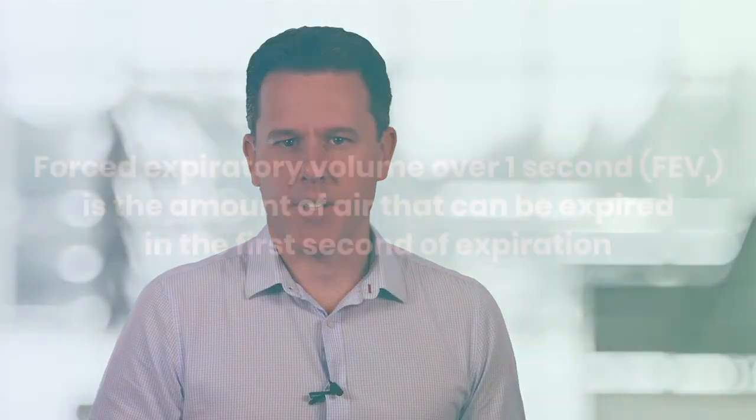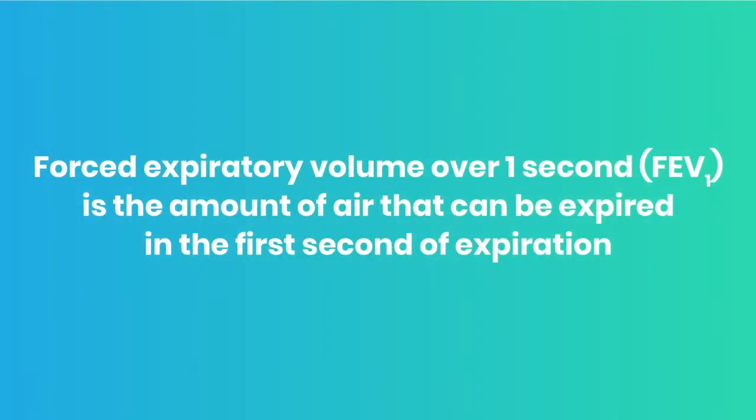The other important measurement is FEV1, which is forced expiratory volume in 1 second. And that's measured during that forceful expiration. The amount of air that can be expired during the first second is the FEV1. And then the total volume, as I said, is the forced vital capacity, or the FVC.